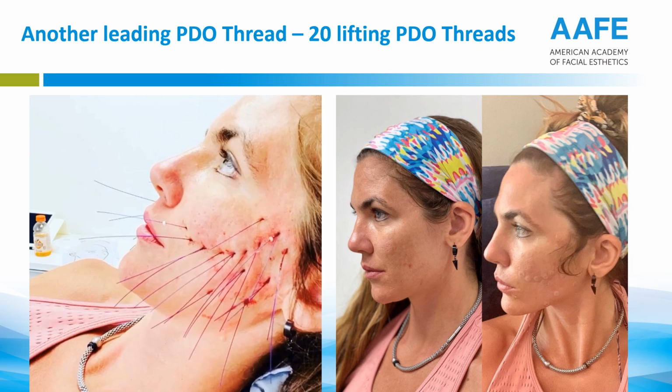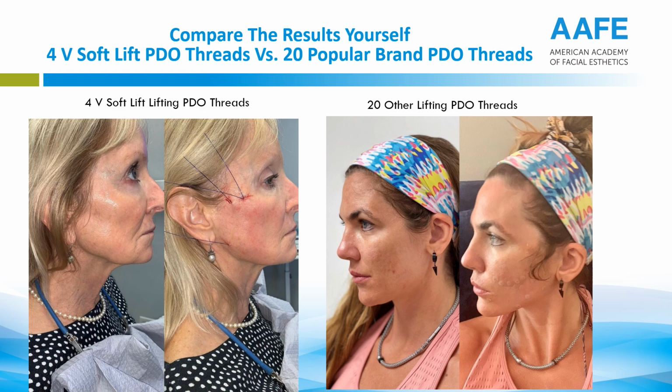And again, they'll tell you on the webinars that you're going to need a lot of threads, and you've got to charge the patient for this, for that. Well, not if you're using the right techniques. I'll let you decide. They get a nice result, but for the same result, would you want 20 threads? Would you want 4 threads? So let's go ahead and show you our first case. And now with that kind of a background, you really understand this a little bit more. Here we go.